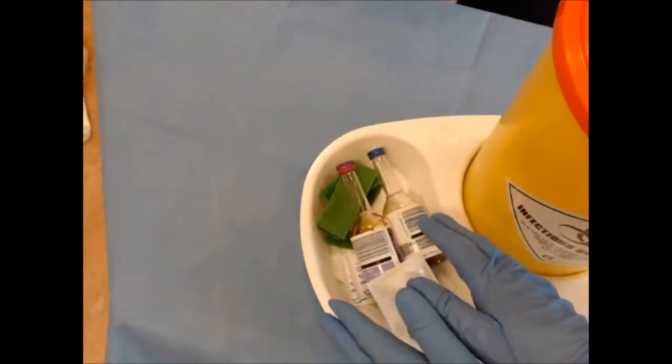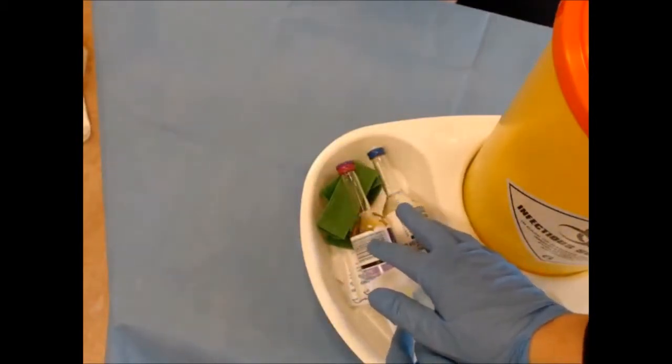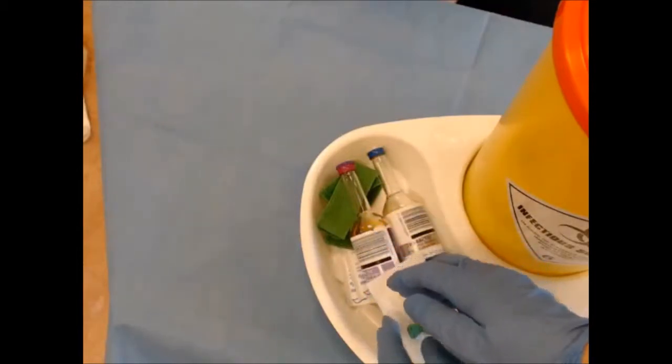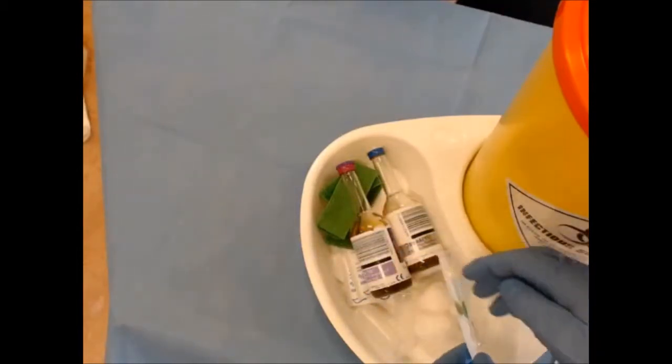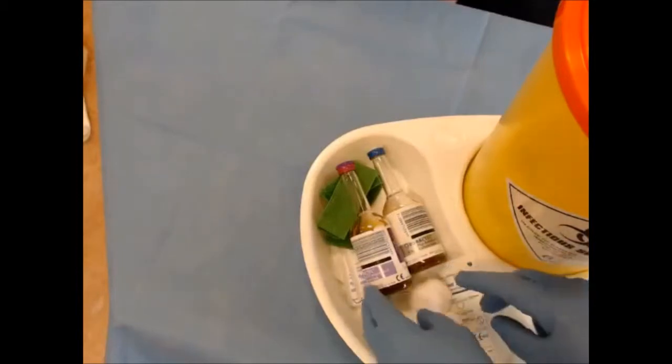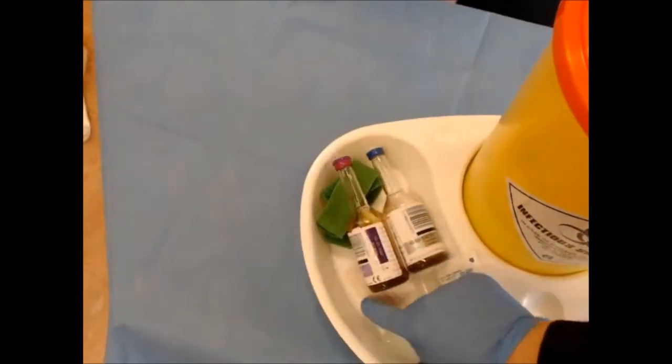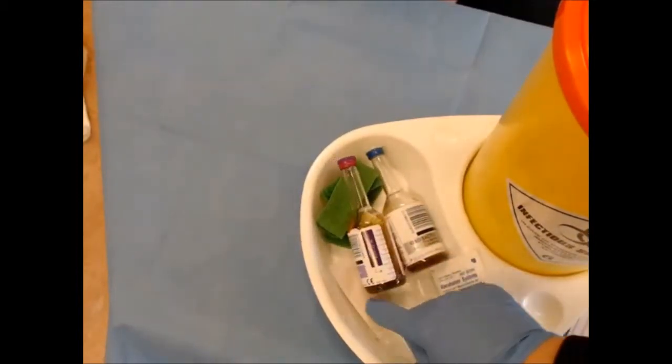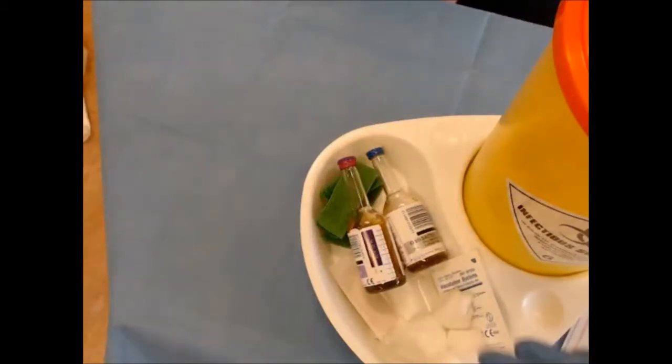If you're taking blood cultures and other bloods, make sure you take the blood cultures first, followed by your coag screen, FBC, etc., whatever you require. You'll need some cotton balls and you will need a band aid or plaster for the patient. So you would clean your equipment and clean your patient and go to the patient.